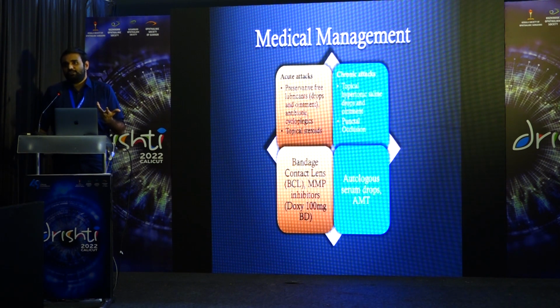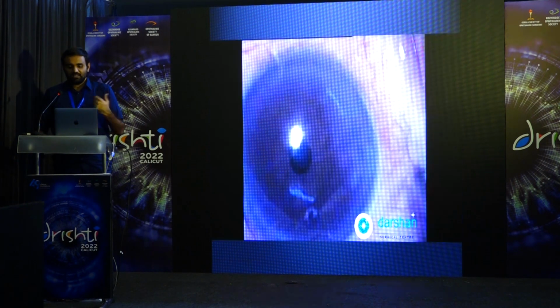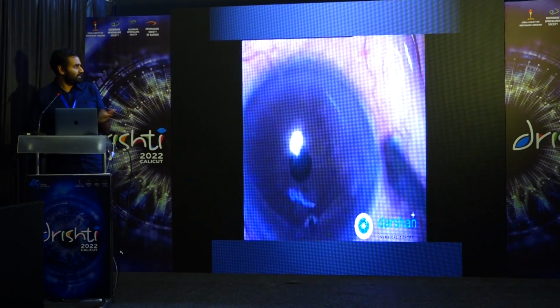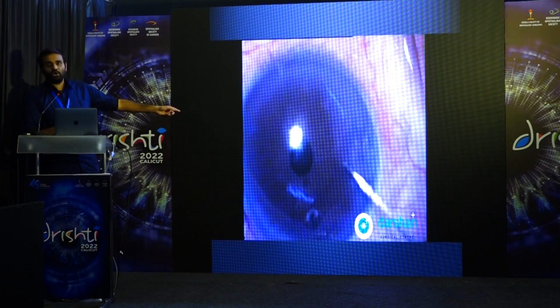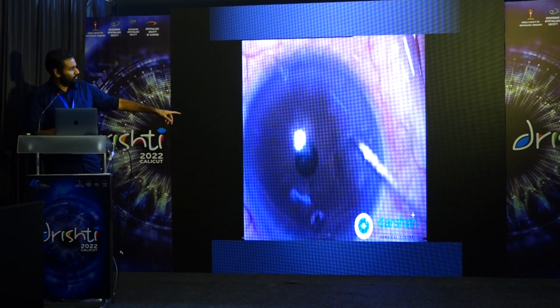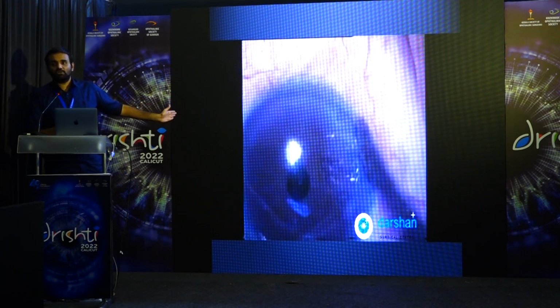But the surgical management is basically where it's at. So recurrent corneal erosion sadly ends up being a surgical problem. This is something that's very convenient, easy to do. This is anterior stromal puncture. Now if you notice, this is a hockey stick knife, it's blunt. When you're peeling the epithelium, it just sort of sloughs off.